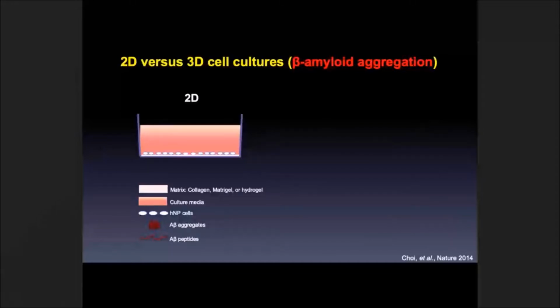Excited. And then when we first make these genetically modified cells, we grow them in the conventional two-dimensional cell culture system. So as you well know, in cell culture dishes, the neurons are differentiating at the bottom of the plate in cell culture media, and they differentiate for 6 to 8 weeks and more than that. And what we found is that after 42 days or even 6 months, we do not see any plaques, any tangles, nothing. It is interesting though, we see a huge amount of soluble A-beta species in the media, but we cannot detect any plaques or tangles.